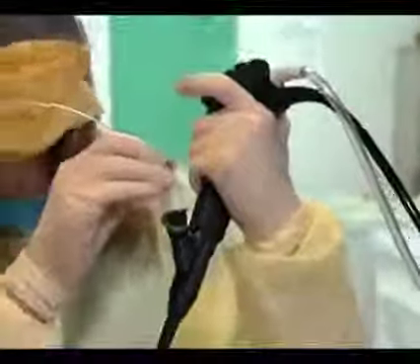So at this point, I'm coming up to my target, and I'll ask my assistant to place the needle out. Needle out. And then I'm using a technique of seating the needle to the mucosa. I have an assistant to hold it in position, and as I advance the needle into place, I can feel a very strong pop through the mucosa.